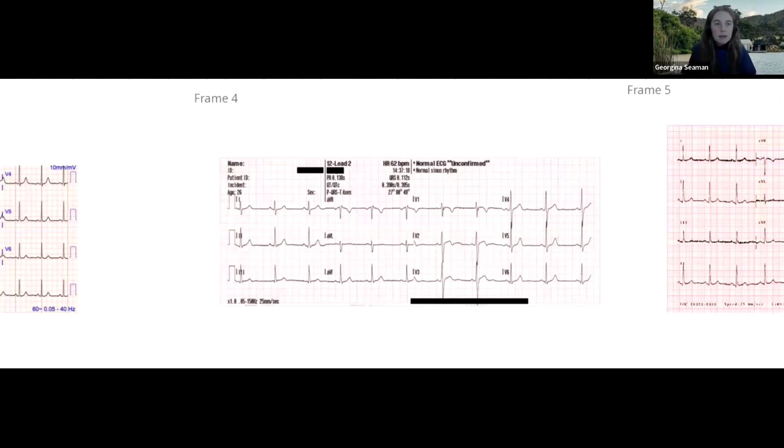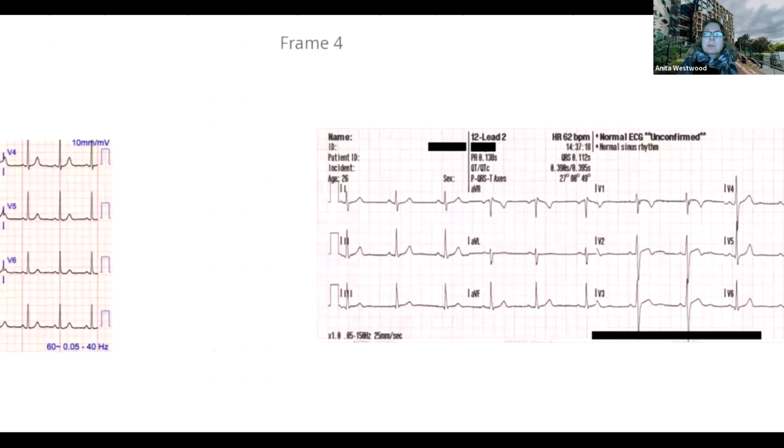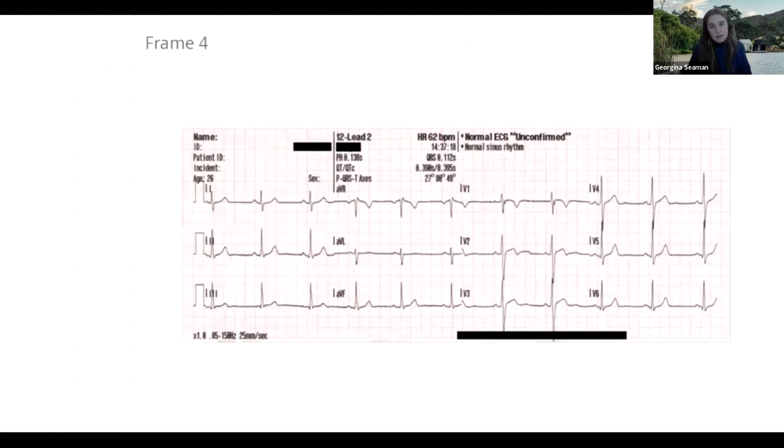Okay, can we have group 2? Have you got your sheets there with the safe principle on them, or that sheet that was before? You just read off that, and then we can apply it to this. So Emma's starting us off with the speed. Perfect. And the amplitude is confirmed in the calibration box.